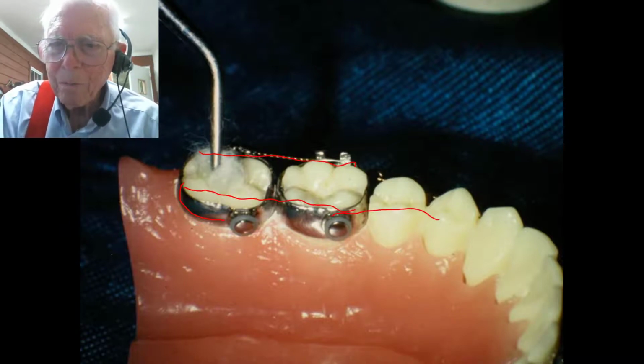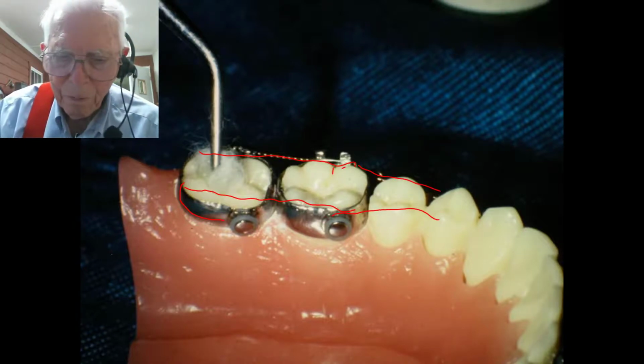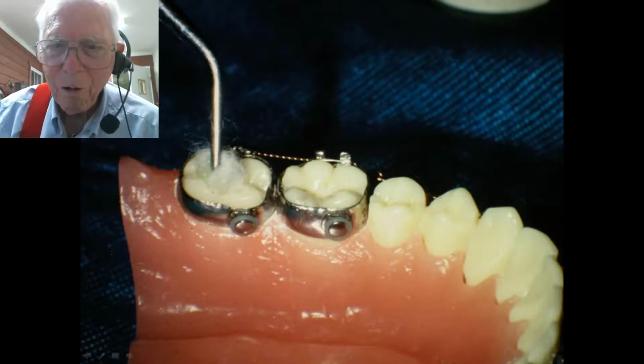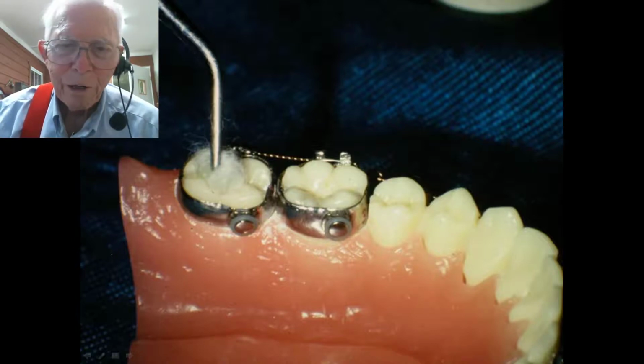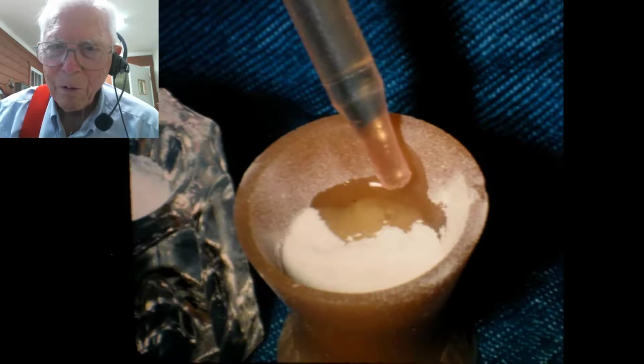And I know several years ago, I had some orthodontists that came to want to know how we got the things off. And it's pretty simple if you make them out of lab acrylic. I made some out of real good composite, and it took half a day to get them out of there. All right, here we put a little liquid on the, you've etched and dried and everything.